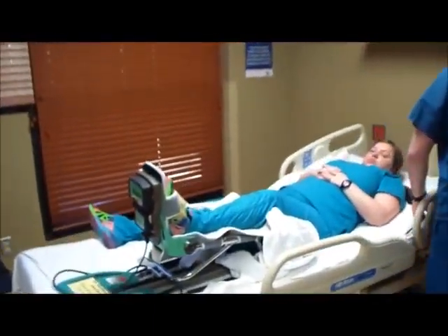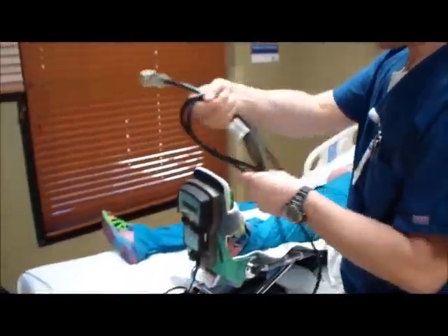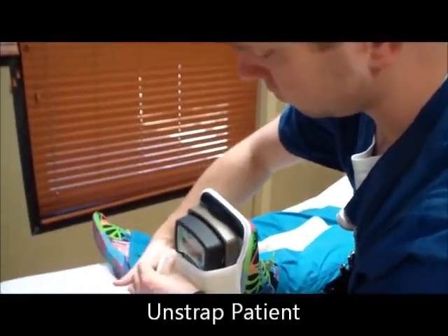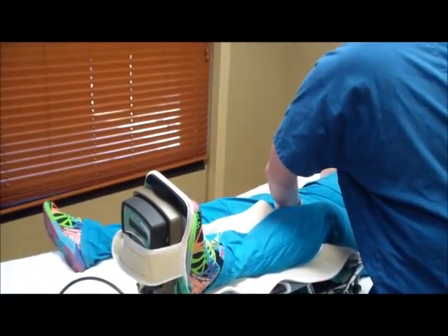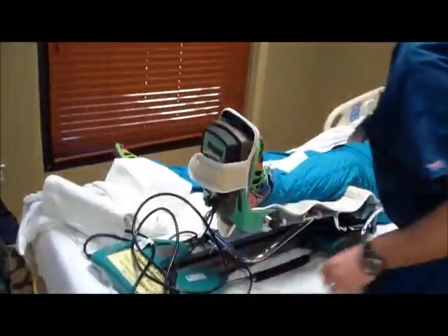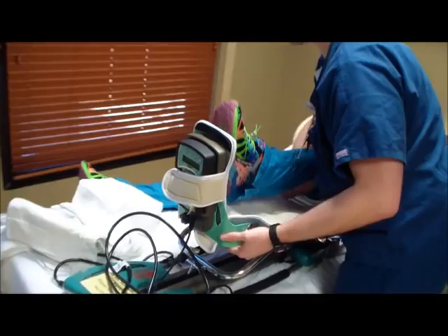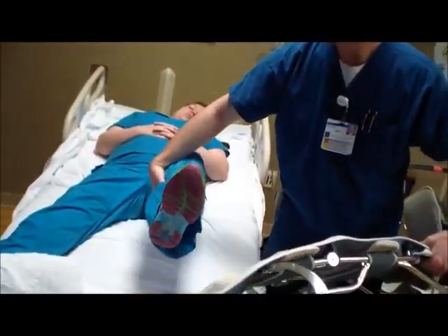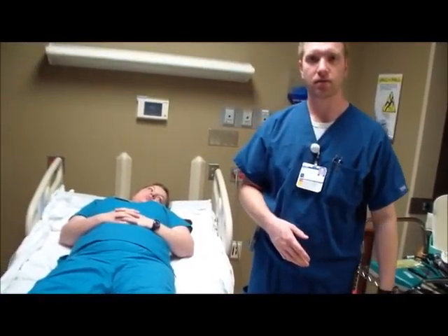So we've got that taken care of. What we're going to do is unplug the CPM. I'm going to unstrap my patient. Make sure we got everything out of the way. And what I'm going to do is help bring the patient's leg up. So we're going to go bottom part out first, and then you bring the top part out. And move it off to the side.